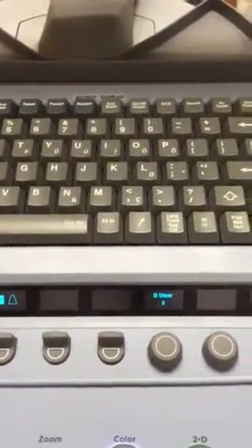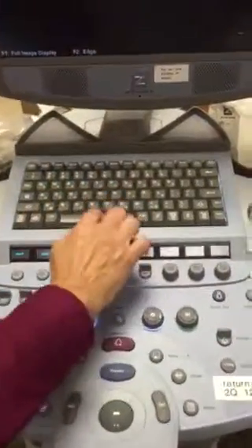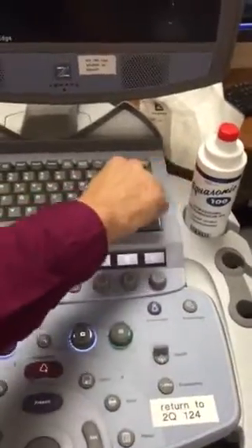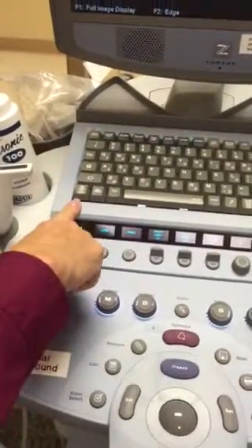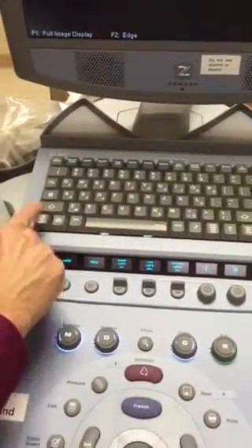Do you see anything else on here that we need right now? Let me go through this. End exam. How about annotations? Just hit your space bar and that will bring up your text key. You can type in anything you want to. To back up letter by letter, you hit this back arrow here. If you want to remove everything on the screen, shift, delete text. If you want to just delete the word, you can hit delete word.